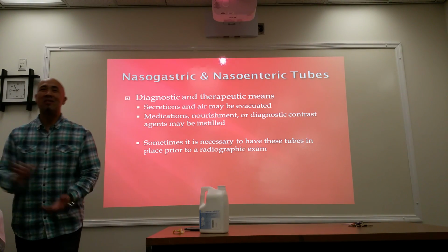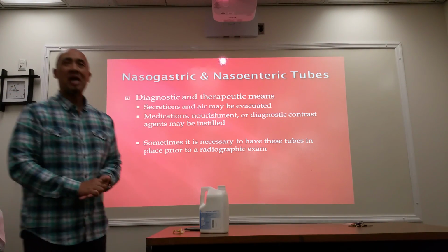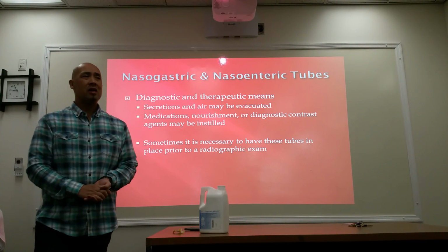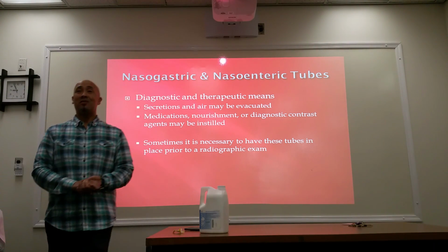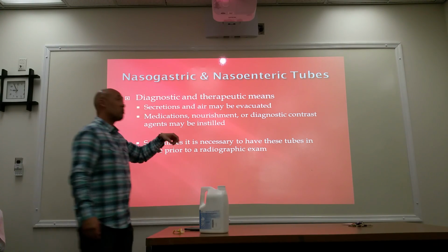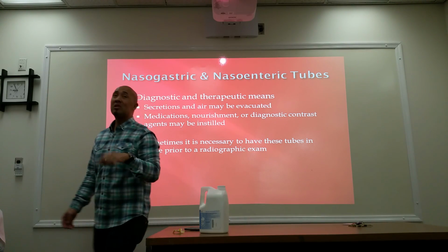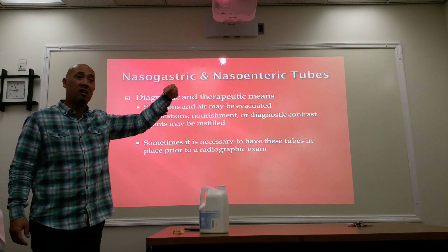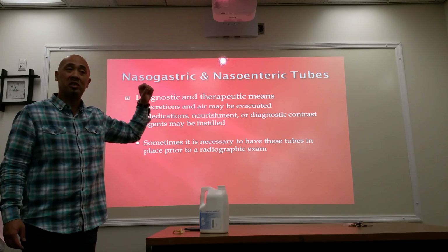All right. Any questions? All right. Let's talk about feeding tubes. Nasogastric or nasoenteric. Nasogastric, the tip of the catheter goes into where? To the stomach, right? Gastric. And for nasoenteric, the tip of the catheter goes in the small intestines, usually in the duodenum or the jejunum of the small bowel. So it goes past the stomach into the first portion of the small bowel, which is the duodenum, or the second portion of the small bowel, which is the jejunum.